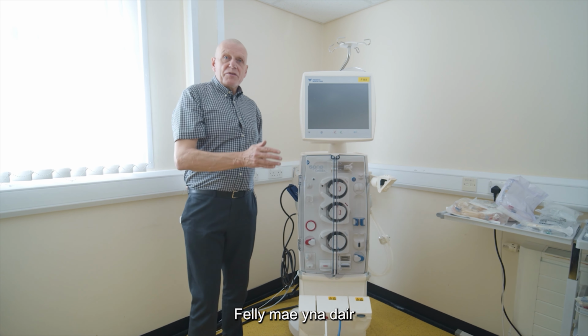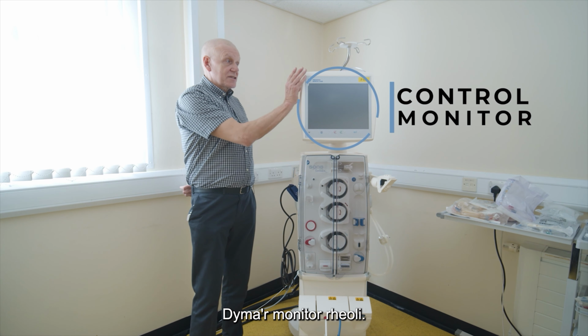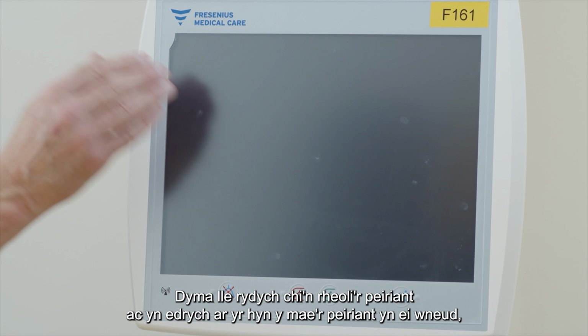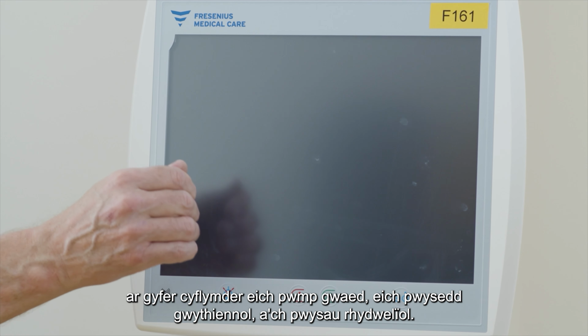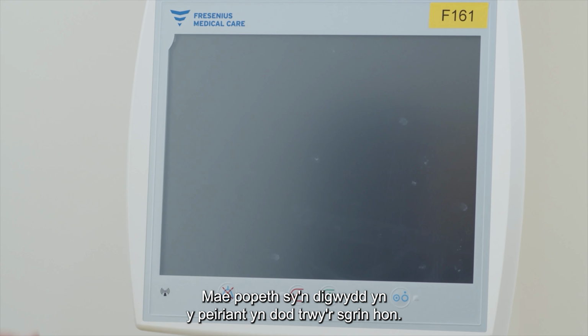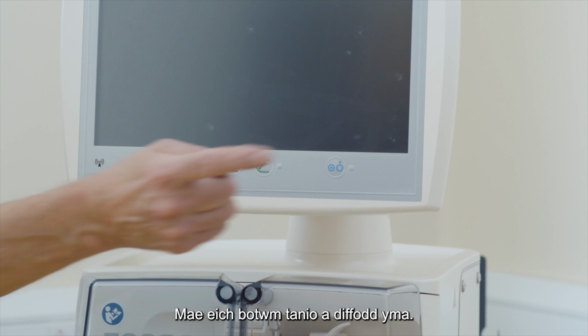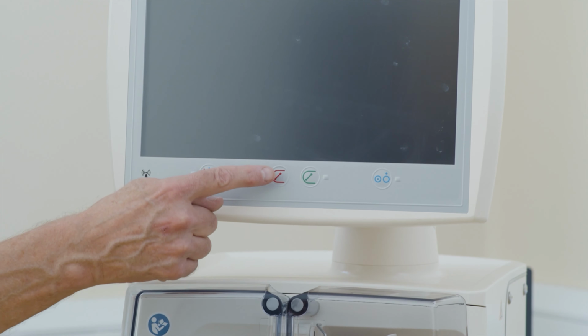So there are three main parts to the Fresenius 5008S machine. There's the control monitor. This is where you control the machine and you look at what the machine is doing, and it gives you all the readings for your blood pump speed, your venous pressure, your arterial pressure. Everything that's going on in the machine comes through this screen here. You have your on-off button here. You have your mute button here. Your blood pump start and your blood pump stop.